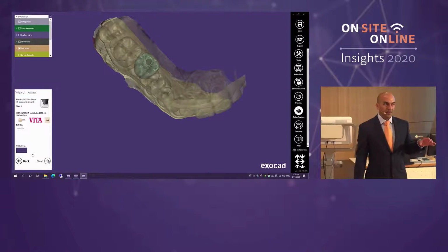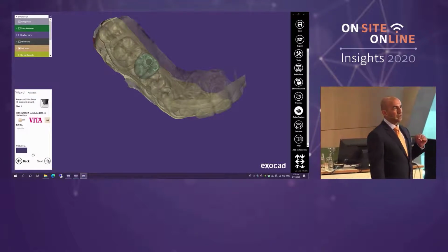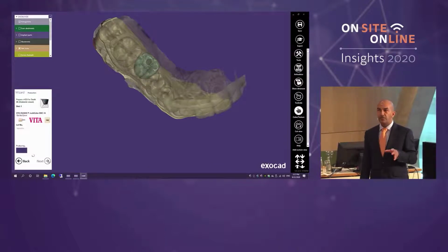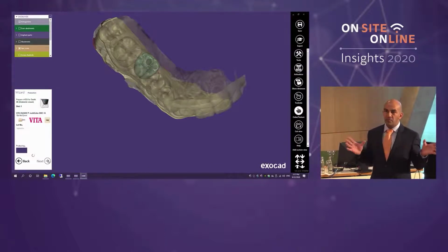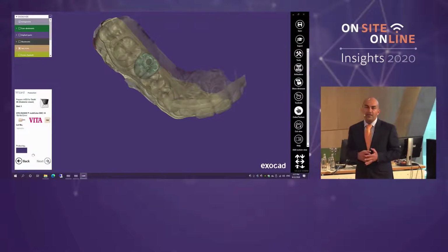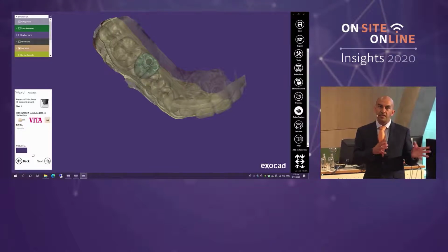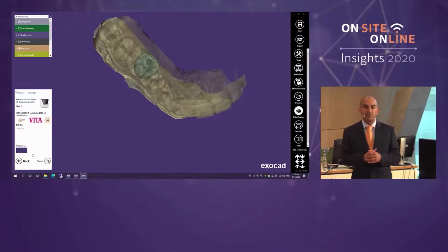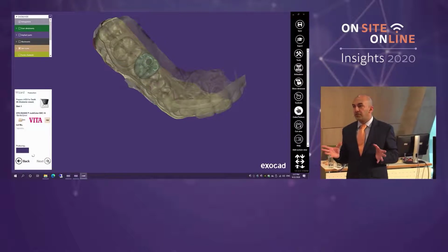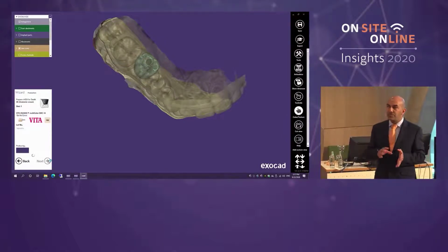Absolutely not. My lab bill annually is around about, in euros, probably around about 48 to 55,000 euros a year. Me on my own, small private practice. Plus, I do chairside CAD every day. I haven't got time to show you just now today, but I could show you the kind of crazy cases that I do with chairside CAD. You can see online I've published some of my cases. Some of the cases that I do with chairside CAD, with any kind of chairside software, Michael, they're cases that my technicians simply wouldn't want.